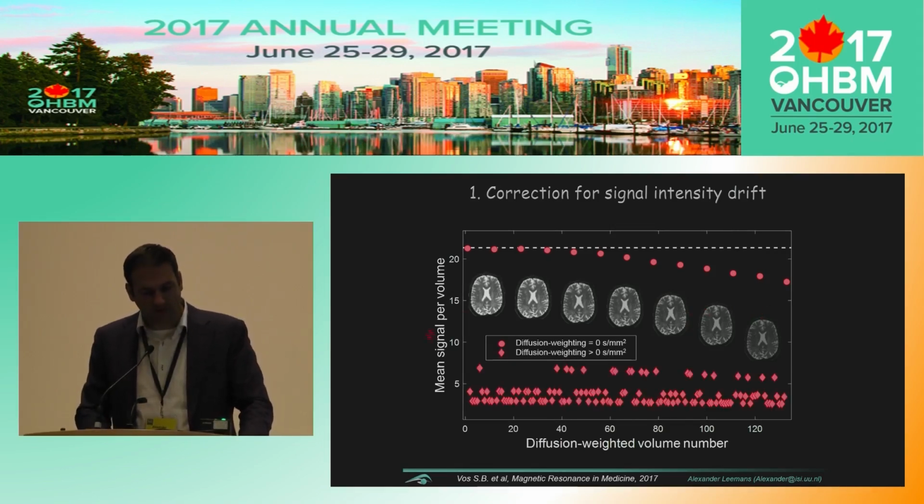neglected. Also because if you look at the diffusion weighted contrast, here the three different rows represent three different B values: B value 1000, 2000, and 3000. You can still maybe observe the trend over here, so it's also decreasing, but with the other B values it's really difficult. And in addition, the contrast in the diffusion weighted signal itself depends on the orientation, right? So this drift is really difficult to spot on the diffusion weighted signals themselves.